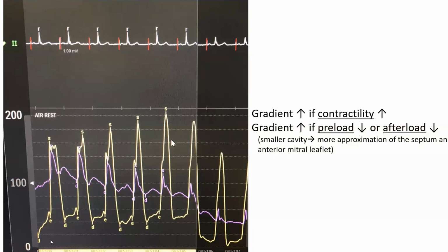That's a dynamic maneuver. Here we made the patient do Valsalva strain, and you can tell from Valsalva strain there is positive thoracic pressure. That's why all of the pressures went up, including that early diastolic pressure. And when we did Valsalva, we went from minimal gradient to a very significant gradient here, okay? And the morphology changed from a normal morphology to, again, late dagger and spike and dome morphology.